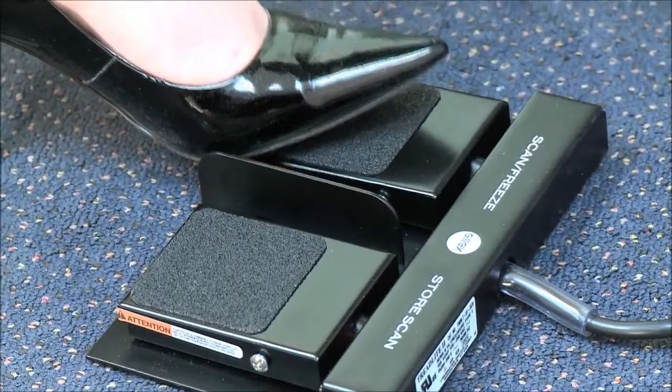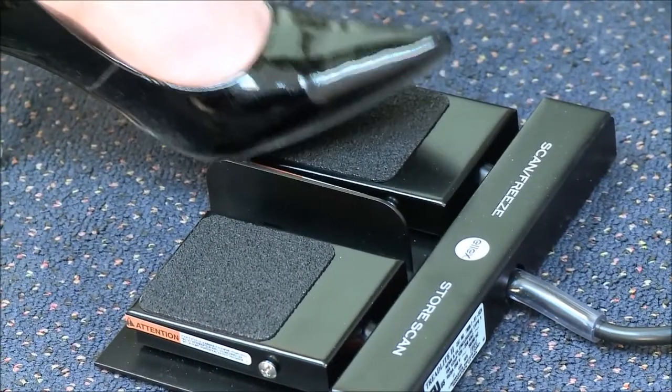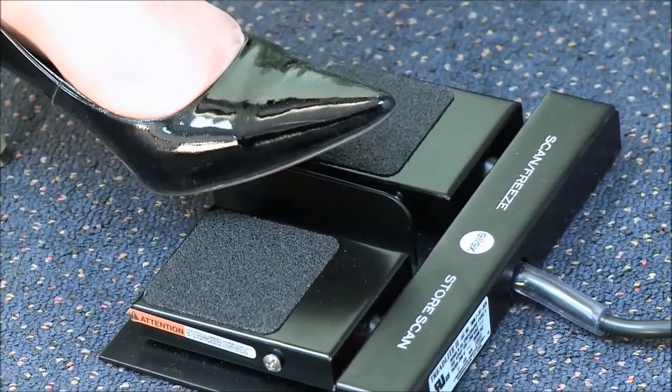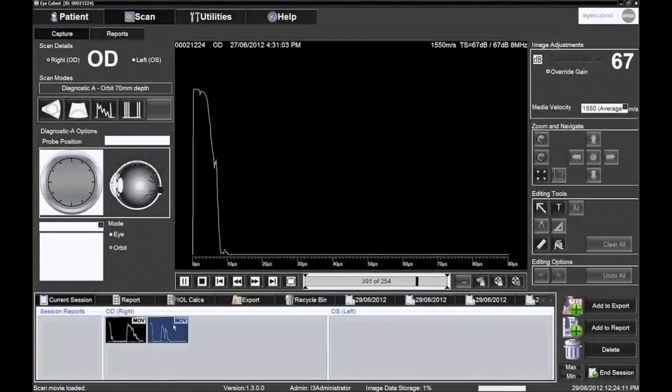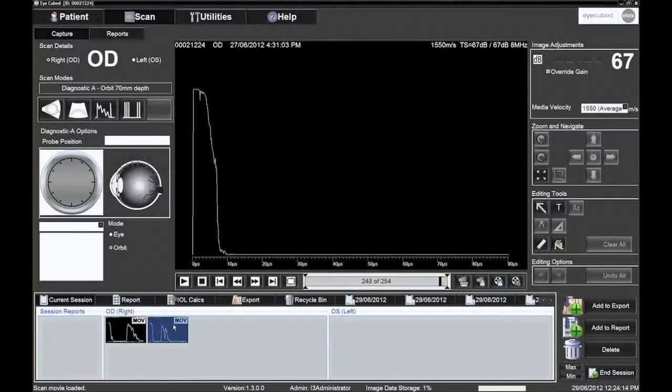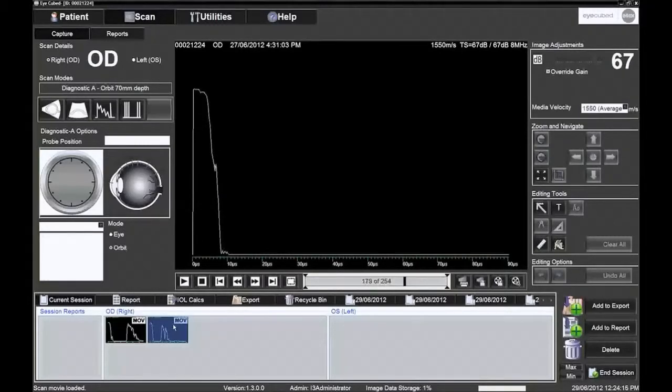Each time the left foot switch is pressed, or F11 is pressed, to stop the scanning, the iCubed remembers the last 5 seconds or 254 frames.